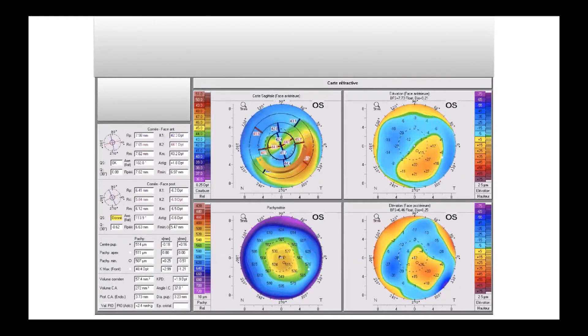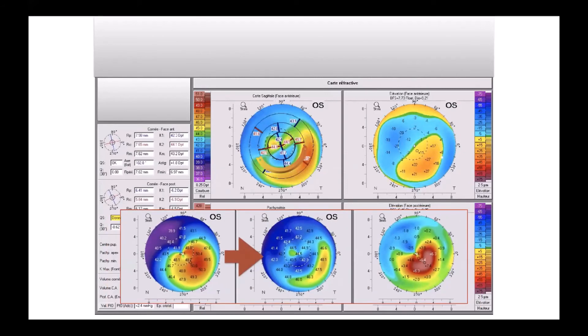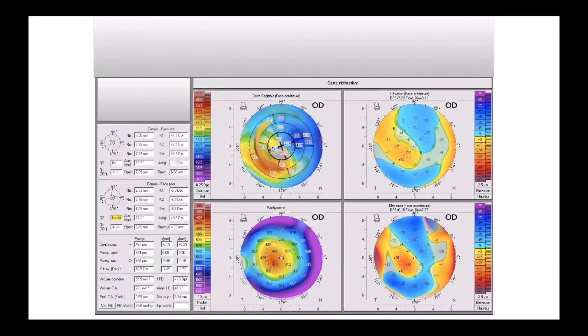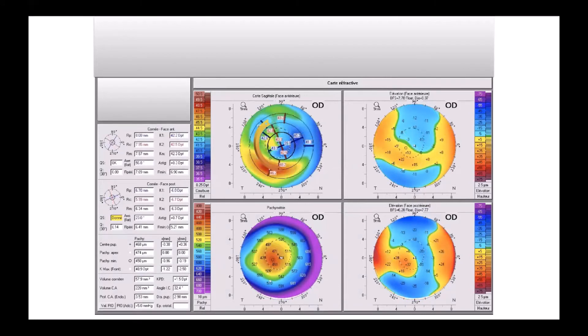Here is another example with an asymmetric intracorneal ring. The result four months later and the differential map show a clear effect even for very small astigmatism. In this case it was just minus 1.3 of astigmatism, but the patient was very unhappy because of coma.